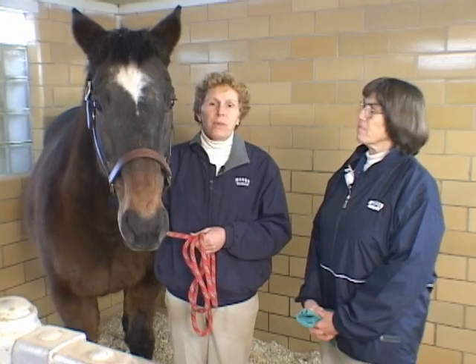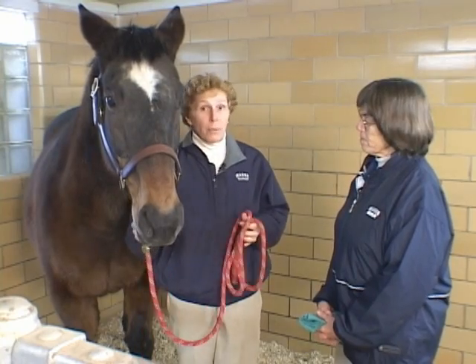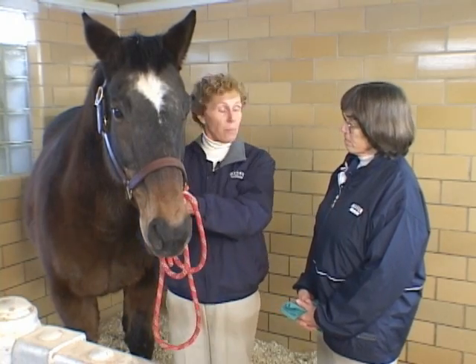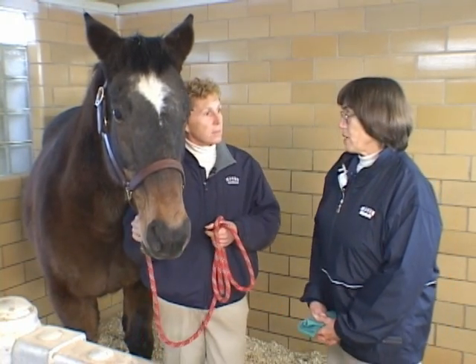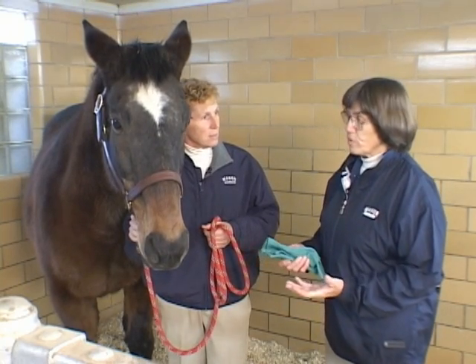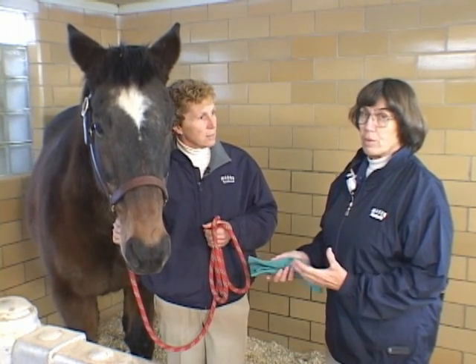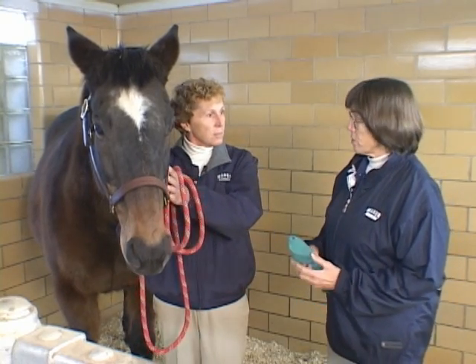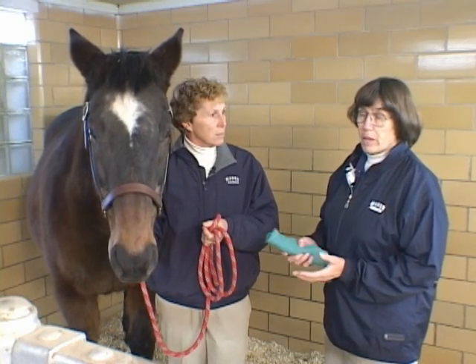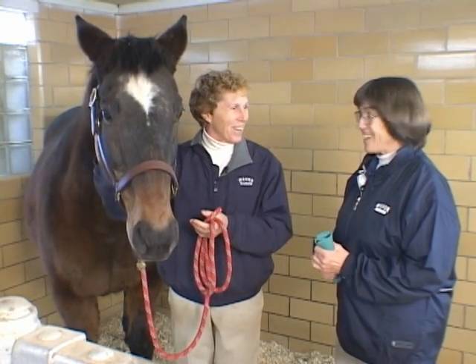The final means of administering medication we're going to demonstrate is passing a nasogastric tube on a horse. There are a couple of different reasons why you might do it. One reason might be to both diagnose and correct a choke, which is a blockage of the esophagus. Another would be when dealing with colic cases — we'd like to pass the stomach tube to see if we have reflux, an increase of fluid in the stomach that we'd like to get out, or to administer large amounts of medication like mineral oil. We'd be giving a half gallon to a gallon of medicine.